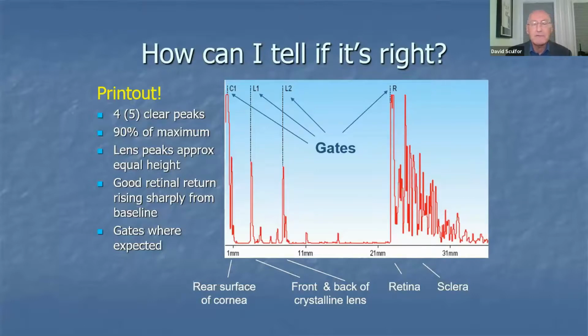So you've really got to compare the scan that's in front of you with this model scan, and to make sure particularly you've got that good retinal return rising sharply from the baseline.